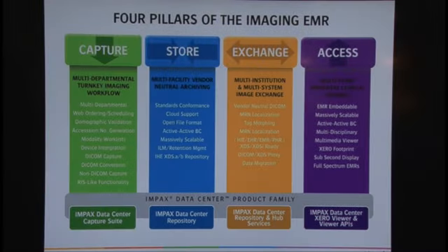The storage pillar, or storage services that the medical image repository must provide, provides for multi-facility vendor-neutral archiving and must provide strong standards conformance, ILM and retention management. It is the portion of the medical image repository that provides for the long-term image store, the physical storage of the medical imaging data.